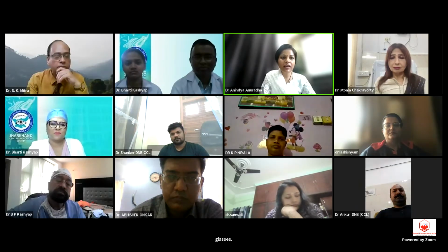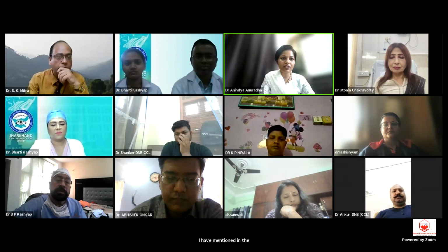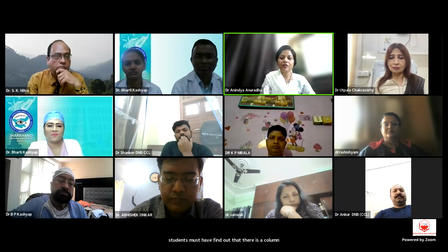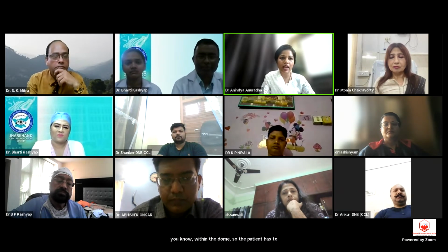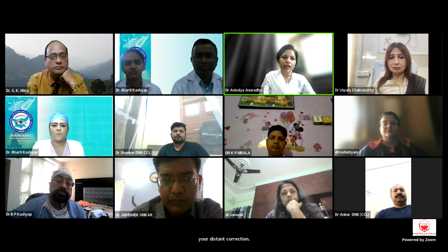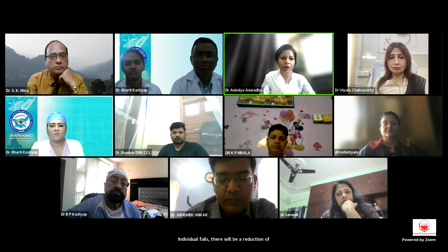Yes, sir. Especially for the first zone I have mentioned in the slide. So there the students must have found that there is a column where you have to put the refraction status of the patient, because in the visual field the patient is within the dome. So the patient has to see the near vision. The near vision has to be absolutely fine. So the near correction should be there along with your distant correction. Otherwise there will be an unnecessary defect in the visual fields. There will be a reduction of sensitivity in all the parts because of the refractive power abnormality.